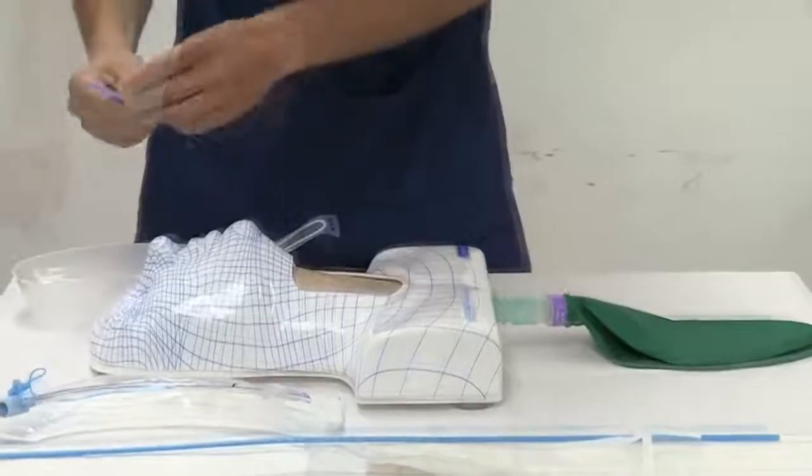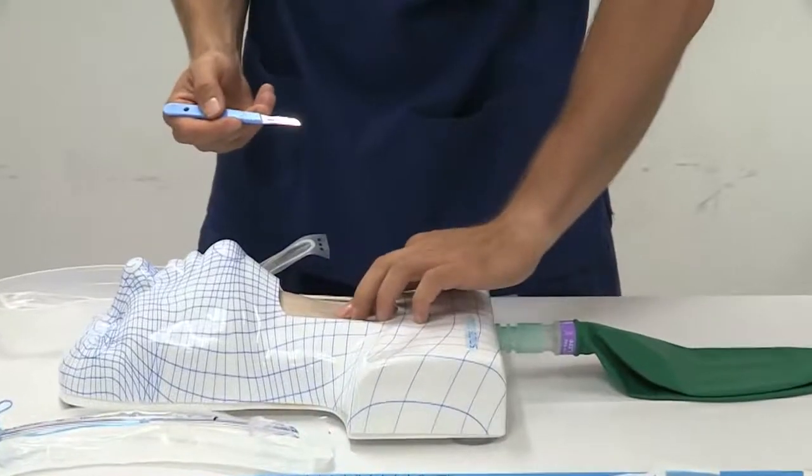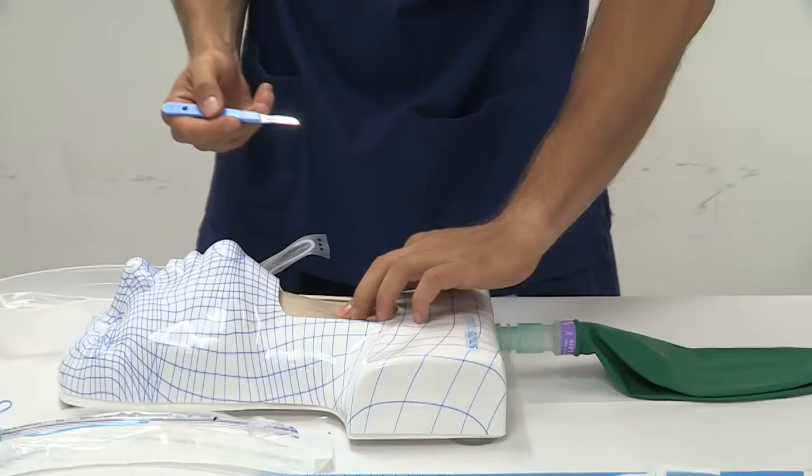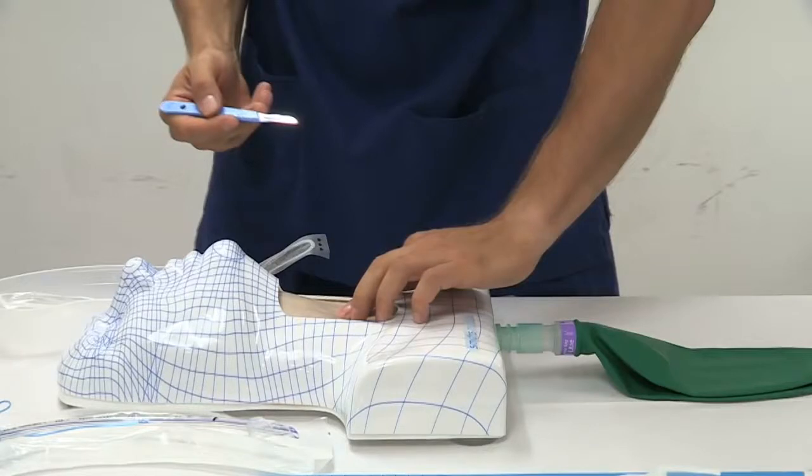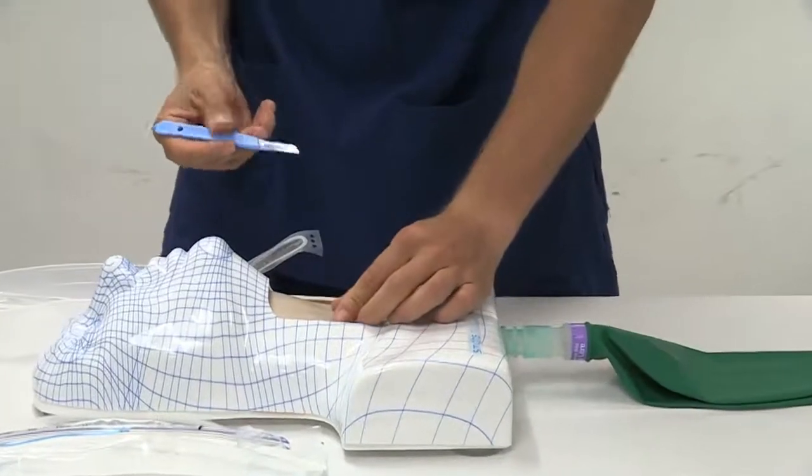The non-dominant hand identifies and stabilizes the cricothyroid membrane. When the cricothyroid membrane cannot be identified, the trachea may be used as an alternative location, but only if it is easily palpable.